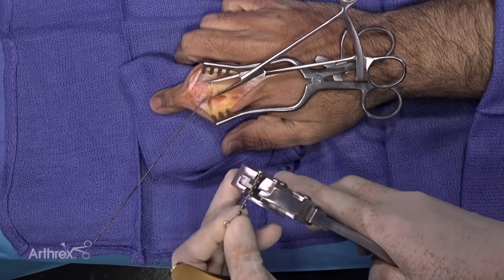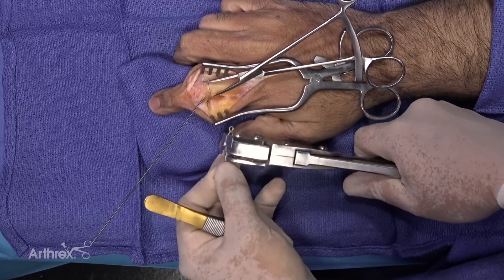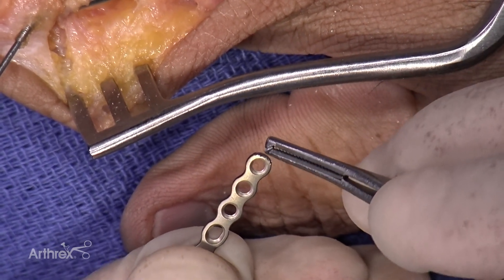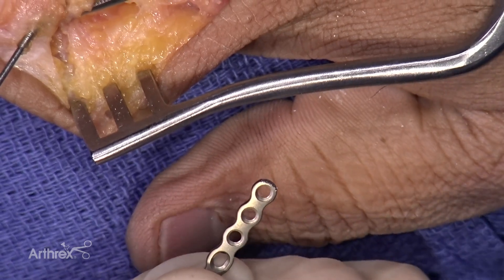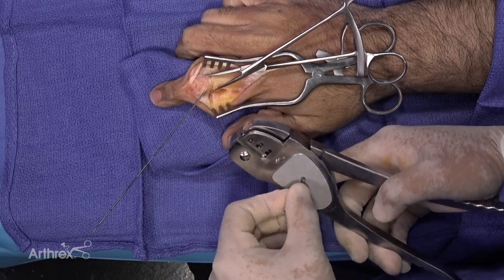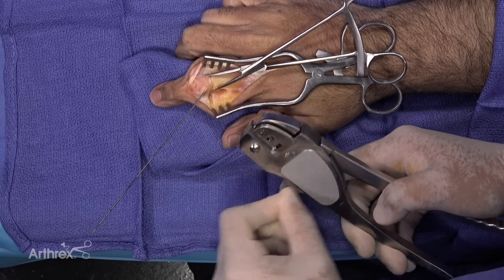We'll cut off about three holes just for demonstration purposes. You'll notice this makes a very easy, round cut with relatively smooth edges. If you feel the edges with your fingers and they're still a little rough, you can use the file on the side of the plate cutter to make them even smoother.